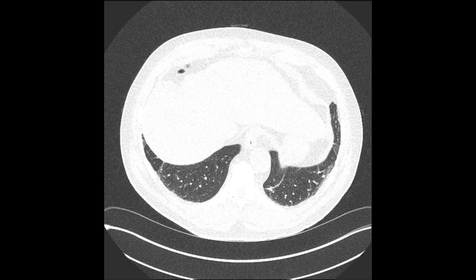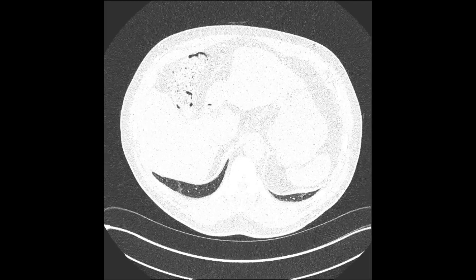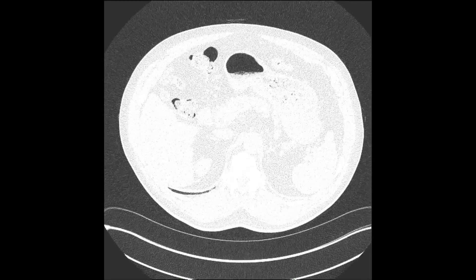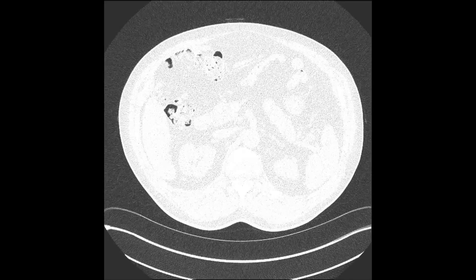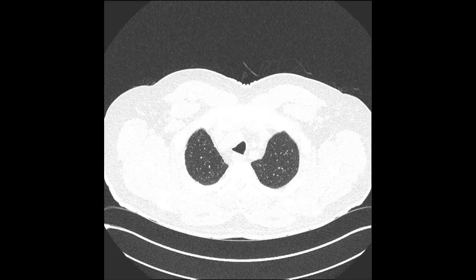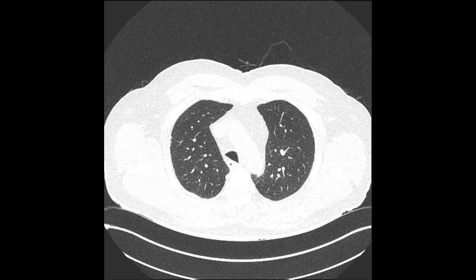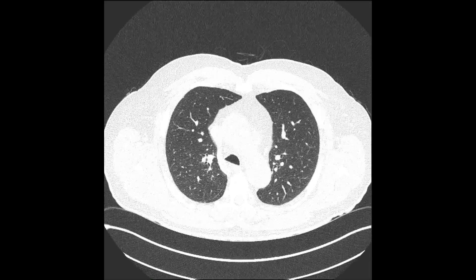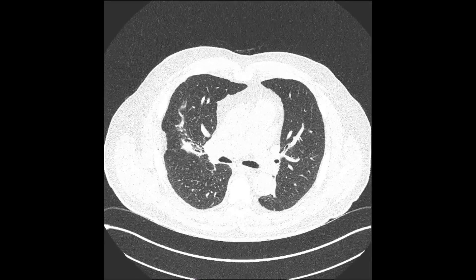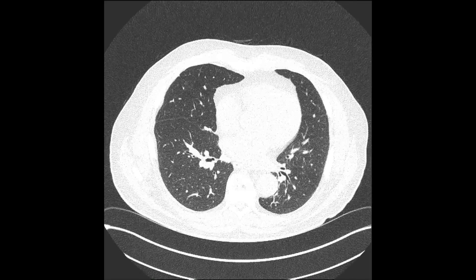Stage 4 is when you get pulmonary fibrosis. As you can see from the scan, it may not be obvious, but this patient has minimal bronchiectasis, although they do have widespread calcified hilar and mediastinal nodes. There are no enlarged soft tissue nodes, the pleural space is clear, and the heart essentially looks normal.